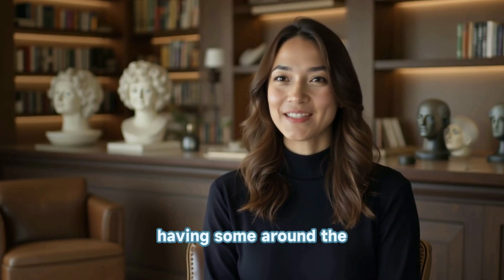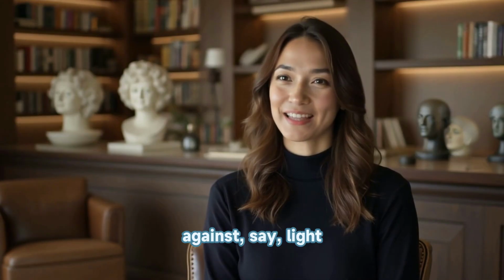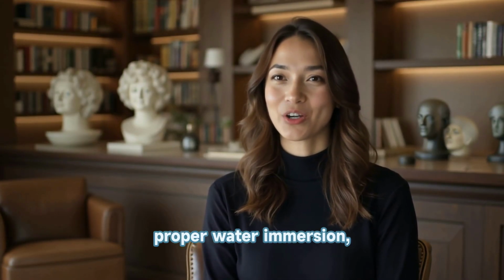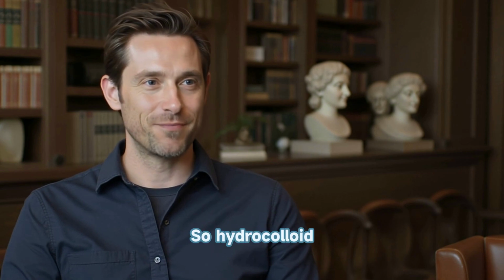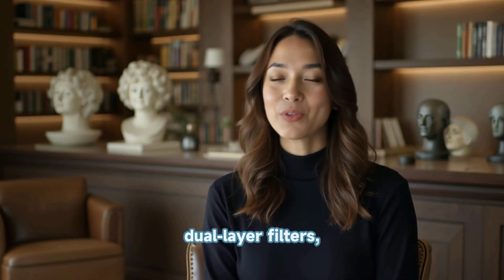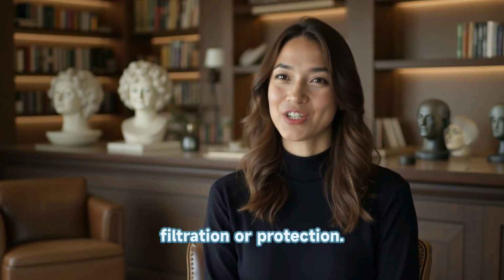Okay. So having some around the filter might offer a little extra buffer against, say, light moisture, but the sticker is still generally needed for proper water immersion, like showering. Gotcha. So hydrocolloid buffers may be different filter layers. Yeah, some might have dual layer filters, perhaps with different materials for different stages of filtration or protection.